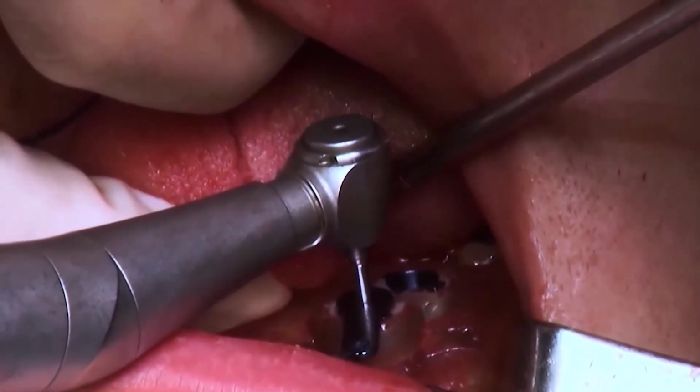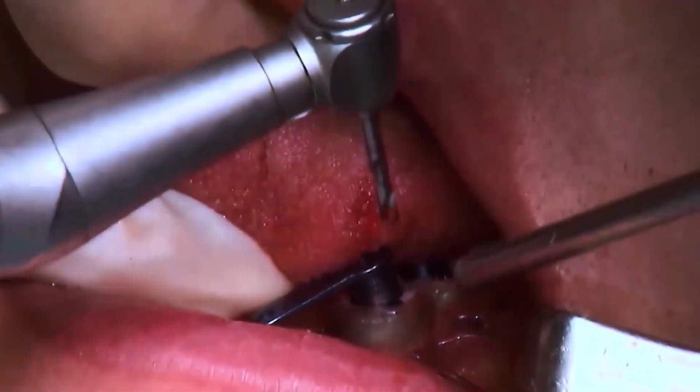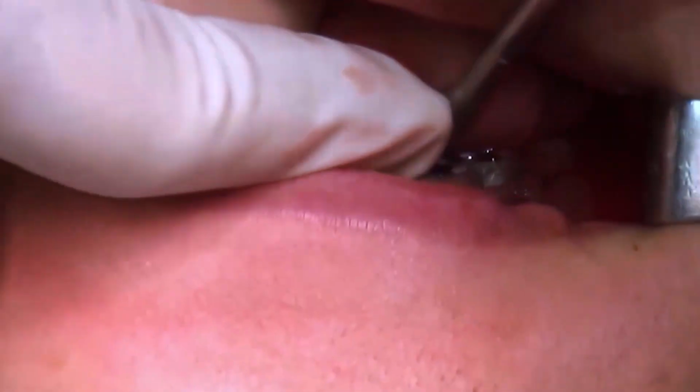The drill speed is also 100 RPM. In between, the osteotomy site is irrigated to remove bone debris and cool the site.